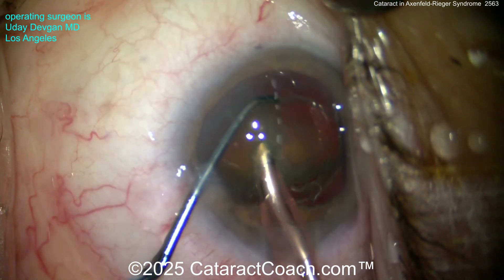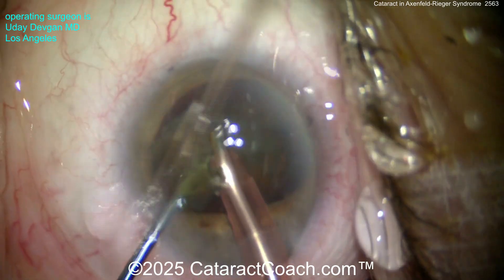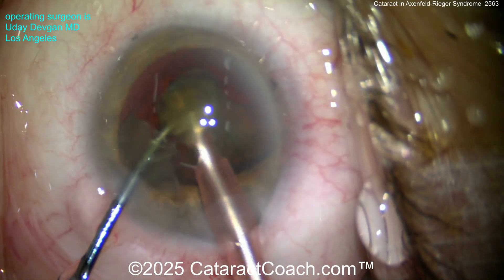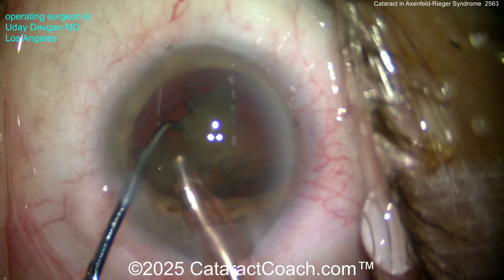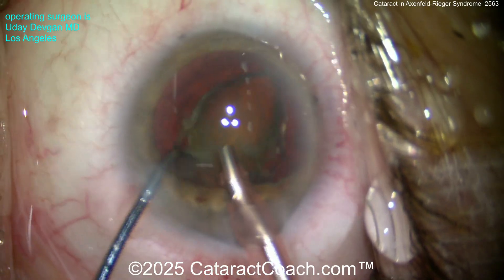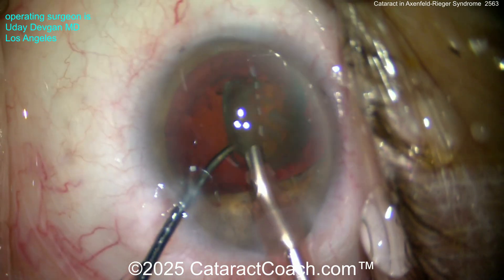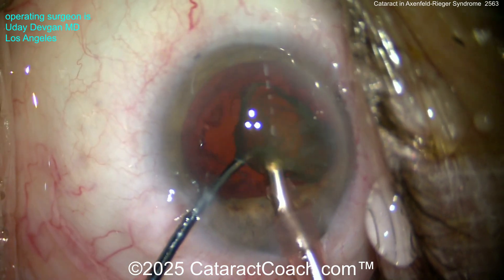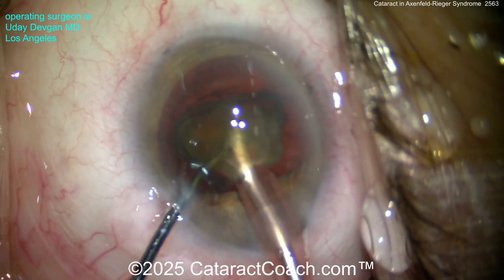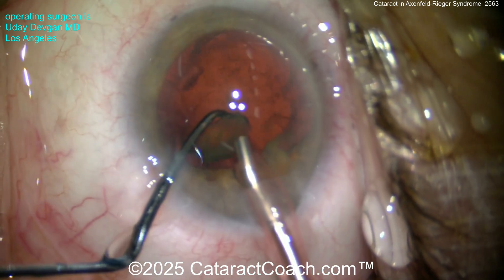These patients have a pretty high chance — about 50% — of having glaucoma. While we're not aware this patient has glaucoma, we're going to refer them to a glaucoma specialist just for monitoring. Odds of 50% are pretty high. Now taking out the nucleus — everything goes as planned.